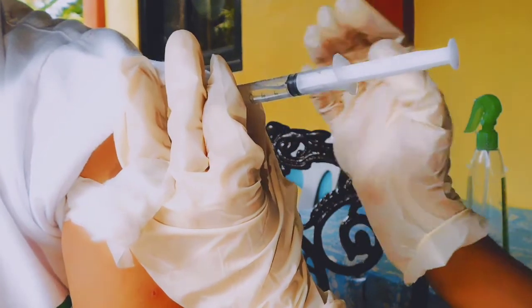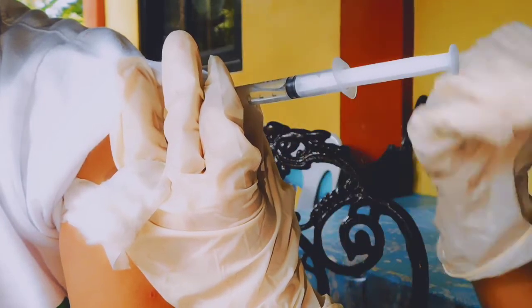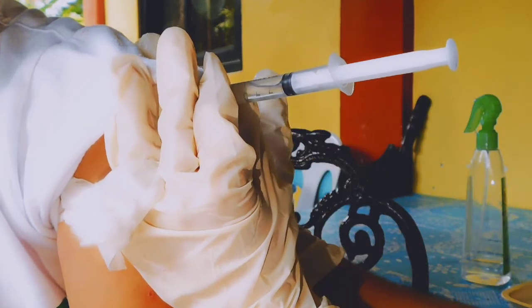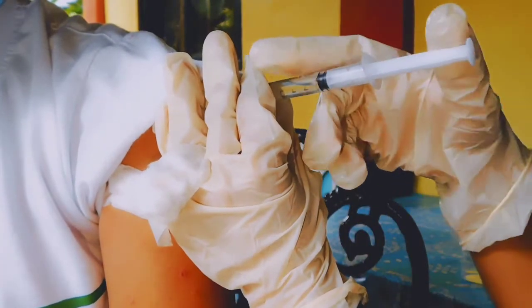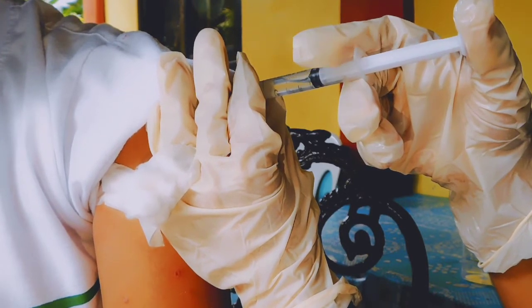If blood appears in the syringe, withdraw the needle, discard the syringe, and prepare a new injection. If blood does not appear, inject the medication steadily and slowly, approximately 10 seconds per milliliter, while holding the syringe steady.